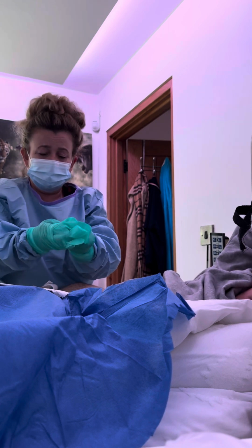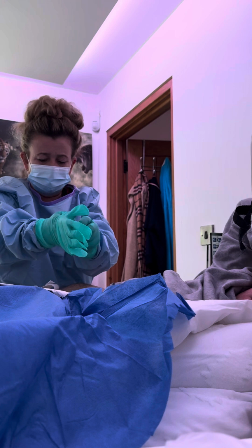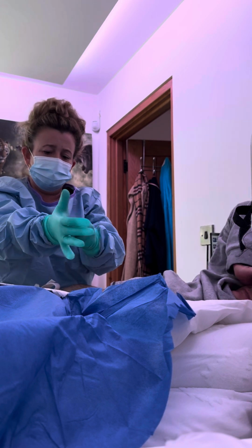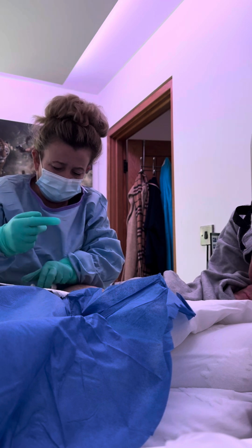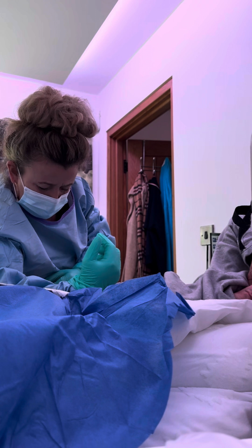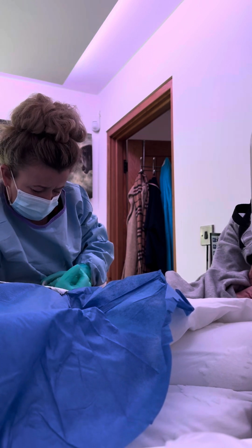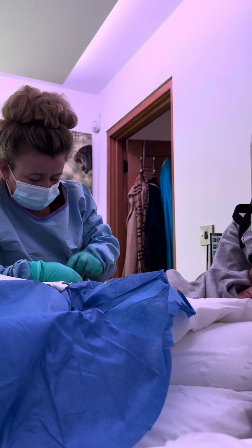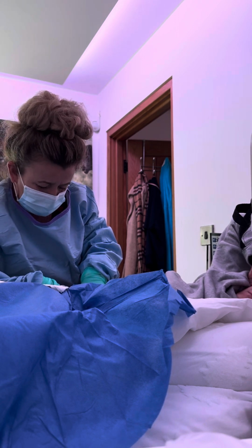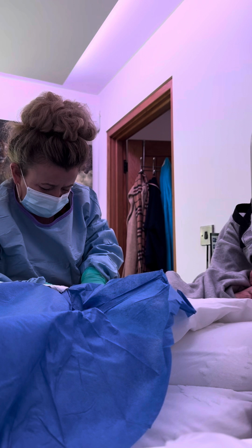You alright? I'm alright, yeah. So I've already got my 10ml syringe. I've done that. And what I'm going to do now is hold his leg with my arm. I'm going to open the stoma, pinch it open. Take a breath. Ready? 1, 2, 3. I'm going to see what's going on.